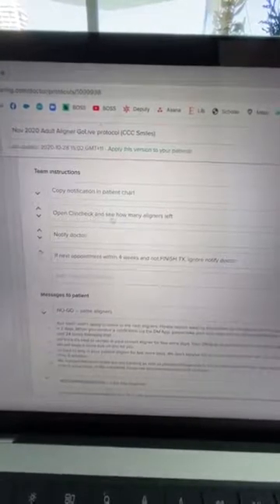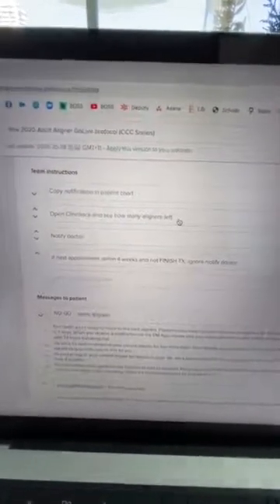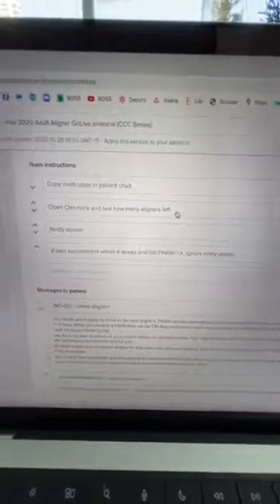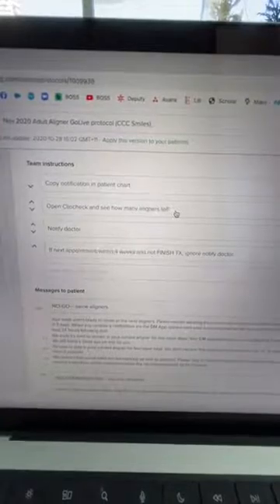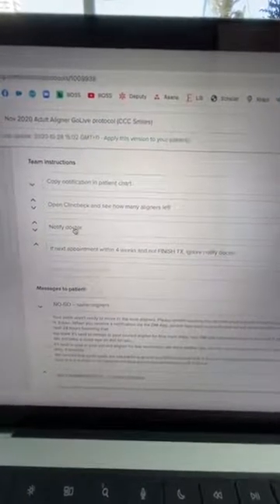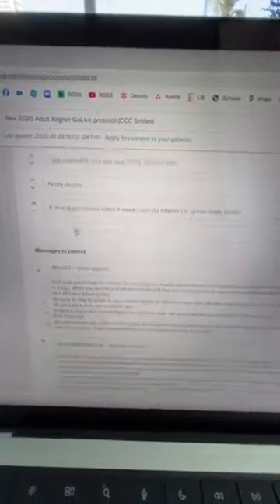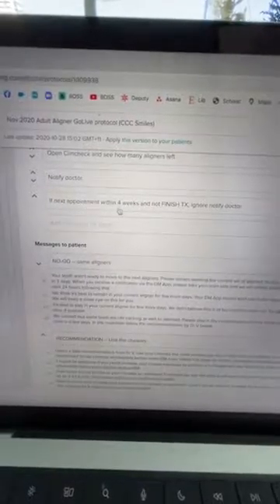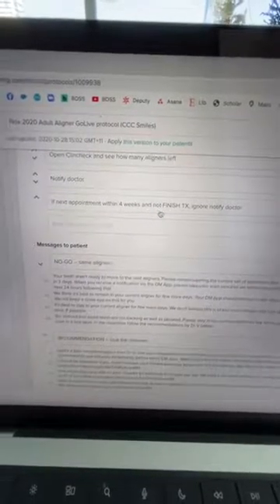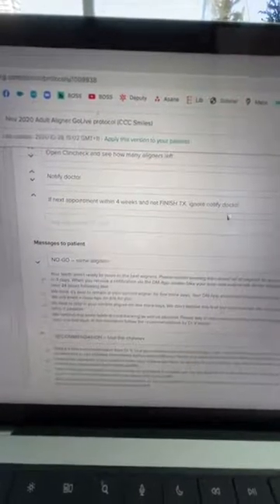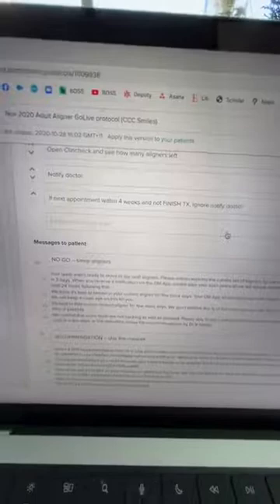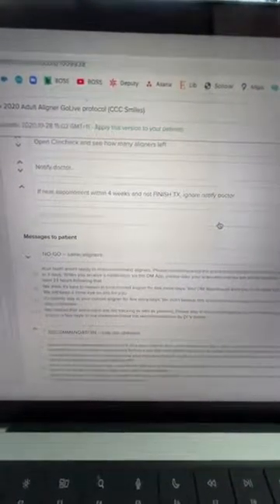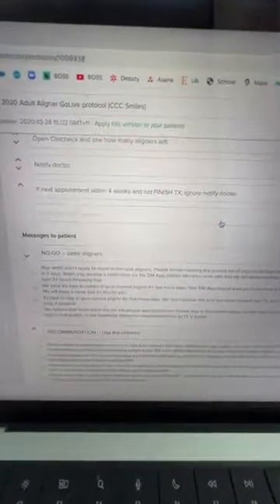I've got team instructions here. I want my team to copy this notification in the patient chart. I want to open their ClinCheck and see how many aligners left, because if they only have two aligners left we're not going to worry about a noticeable unseat. If they've got 25 aligners left we need to worry about it. They need to notify doctor - take a screenshot and let me know. If the next appointment is within four weeks and it's not a finish appointment, ignore notify doctor.